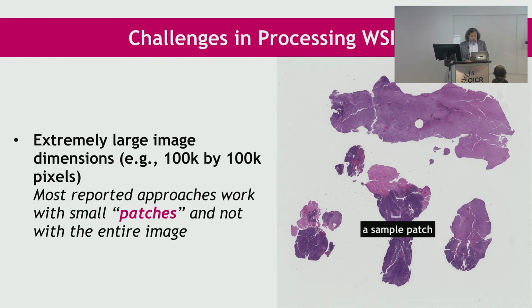Another challenge is that these images are big. These images are gigantic. Everybody loves 40x to look at the microenvironment, but then you have a 100,000 by 100,000 pixel image. You cannot even load it into the memory at once. You have to look at it piece by piece.